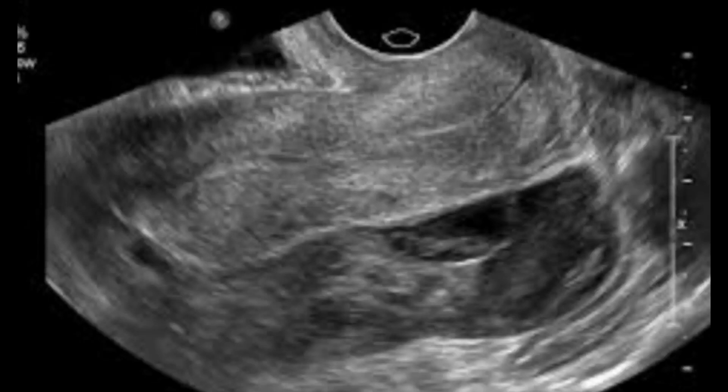So the patient would be put on antibiotics and anti-inflammatory medication. After that, you have to scan the patient. If it is responsive to the medication, fair enough. If not, this would definitely be a chronic complicated pelvic inflammatory disease that would need further intervention. So it should be mentioned on the report properly.